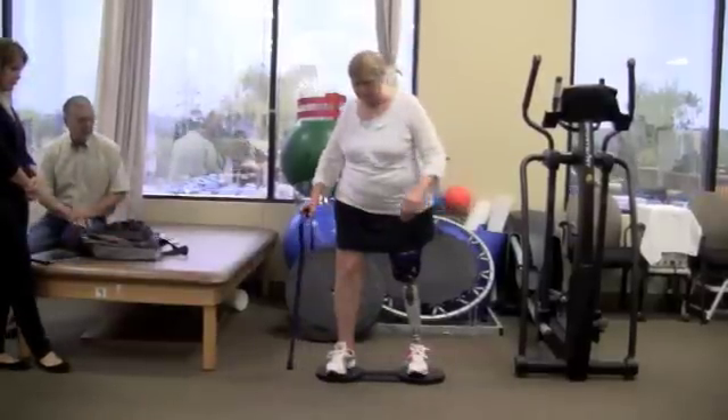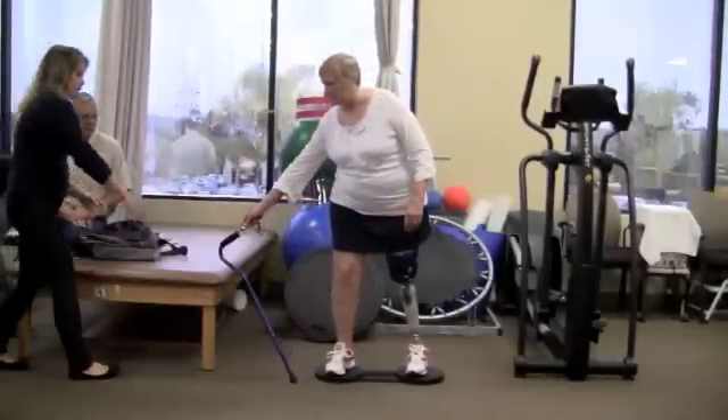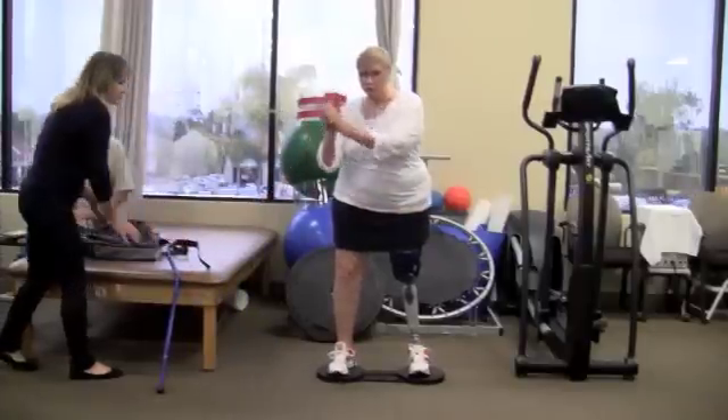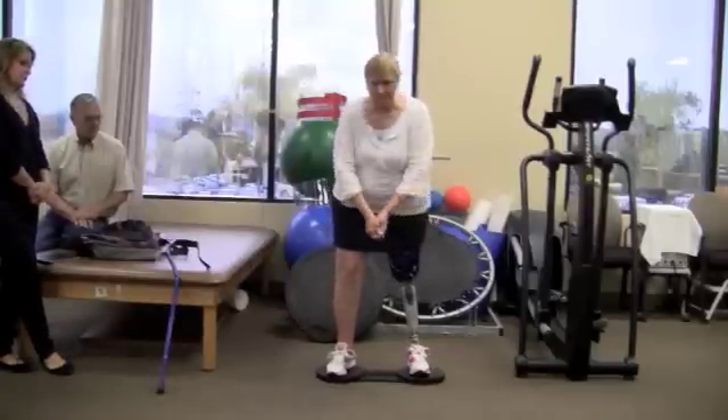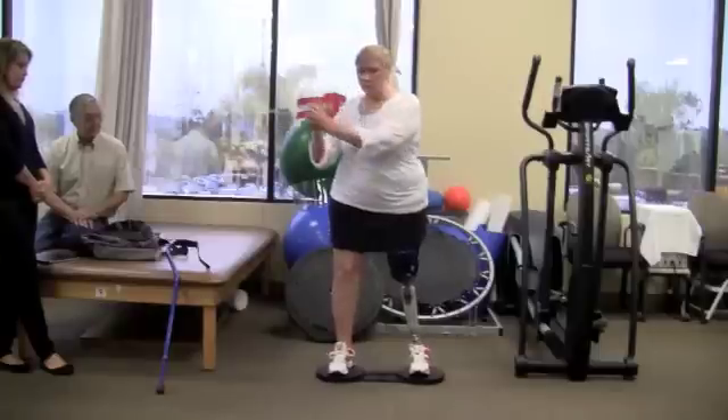As an above-the-knee amputee, I fell frequently, losing my balance when I would try to twist to do things as simple as closing a door or looking over my shoulder. My physical therapist helped me with improving my basic balance, but I still had the problem of falling in these situations.